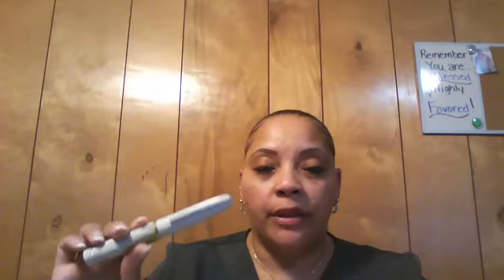Once I'm done getting him situated, I will take this back to put this back in his Med Pyxis. Once I'm done, I will apply pressure to the injection site for 60 seconds, and then I will release. I will reposition the patient, have him back into a comfortable position. I will ask him if he has any questions about the medication that he just received.